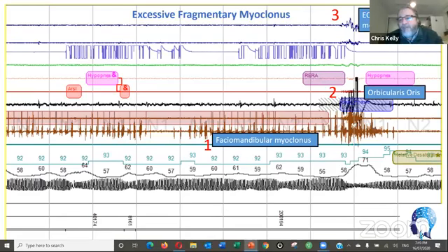So we've just confirmed why they've got TMD, because even though they don't have a lot of bruxism in the test, when they do, they make it really a good one. They do it really well. They're experts at it. So that's autonomic arousal as well. That's muscle activity activation. So what have you got to add about autonomic arousals, mate?